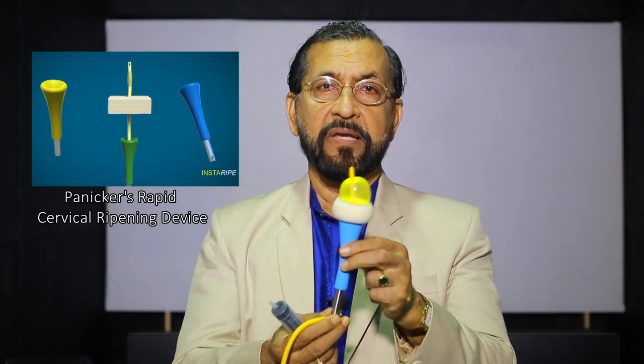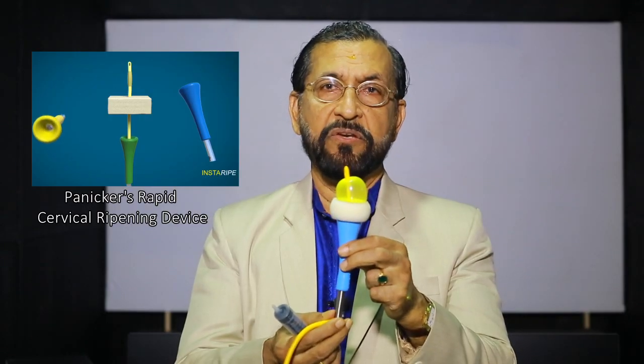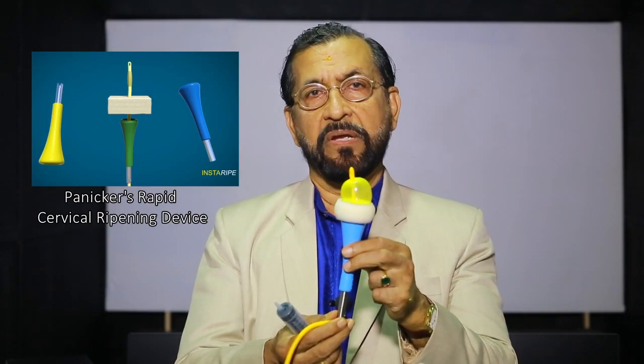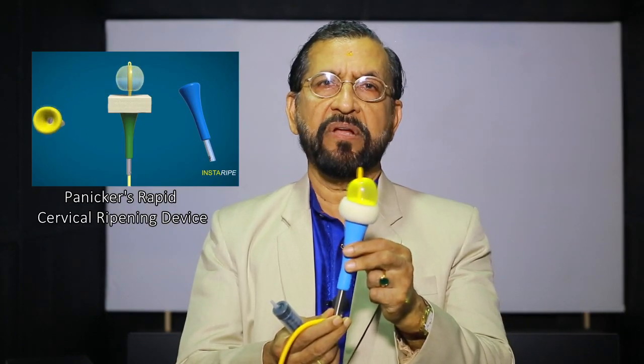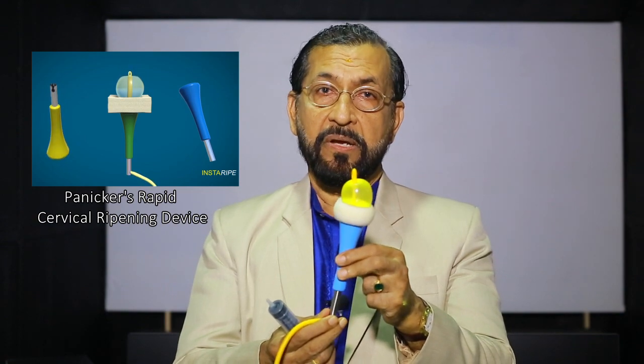This is particularly useful in previous cesarean section when you want to induce, or in IUD when you want to induce. Excellent device. Very inexpensive. It can be autoclaved and reused many times.